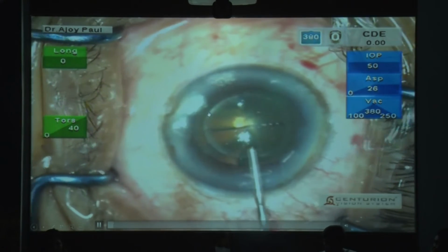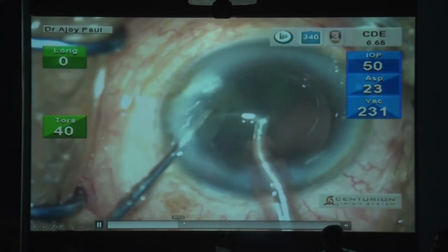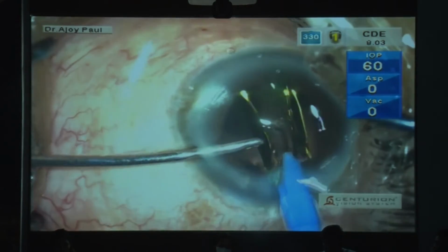Look at this. These are the 2 cuts that have come intrastromal, and as you go ahead with the surgery, you can open them, and at the end of the surgery, in these cases basically we do up to 1 diopter.